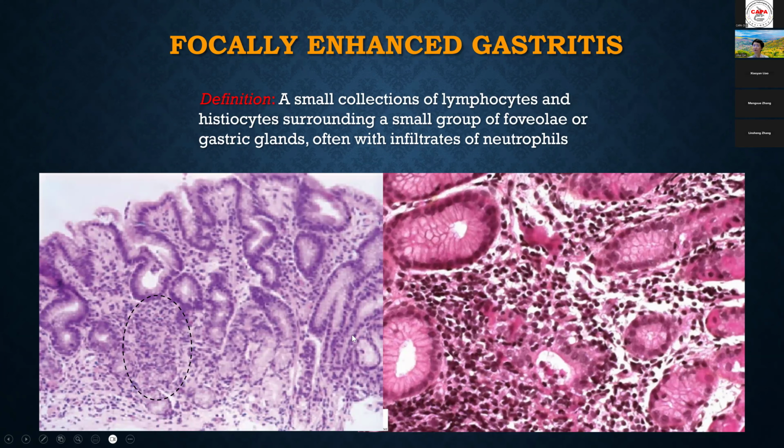And focally enhanced gastritis. This terminology, not everybody will accept. What that means is, when you do an upper GI biopsy, a gastric biopsy, most of the biopsy looks okay or only mildly inflamed, but you do see some areas that are very severely inflamed. On high power, you can see a dense lymphoplasmacytic infiltration, and there is crypt damage, but it's only focal. You may see just one or two foci in one biopsy. So some people use this term focal enhanced gastritis.